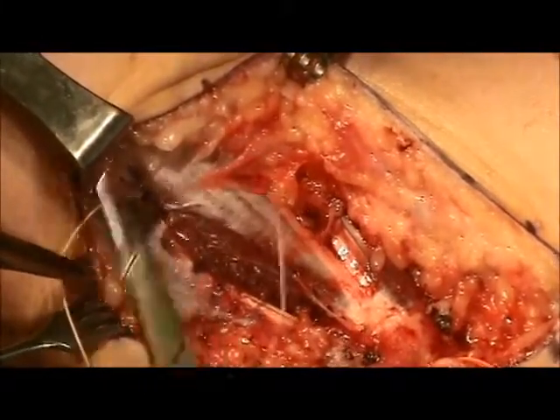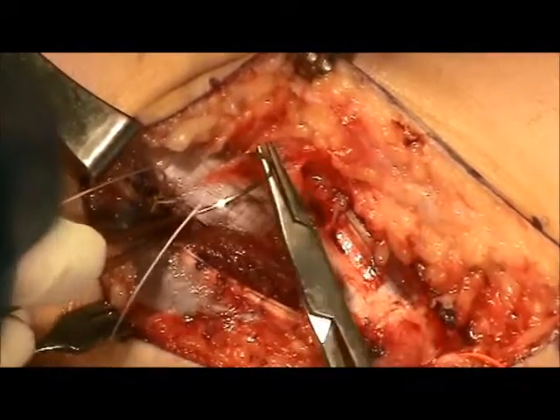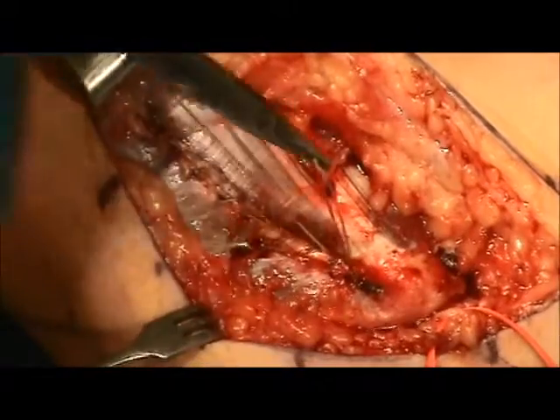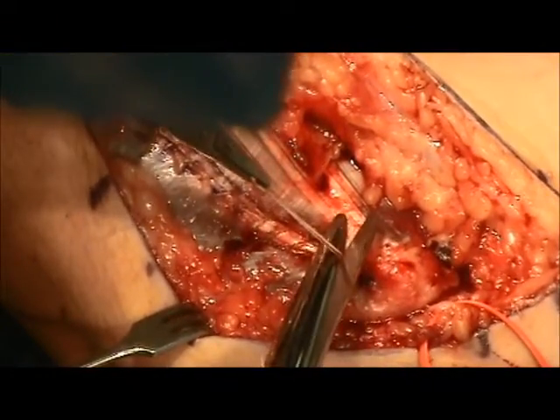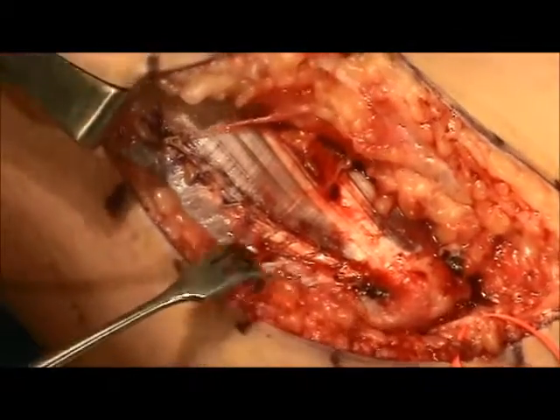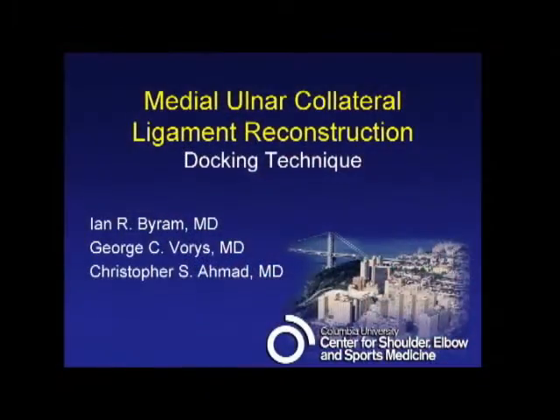The fascia is then closed with running absorbable 2-0 suture. Here the fascia is repaired, and then the skin is closed routinely. Sterile dressings are applied, and the patient is placed in a splint.